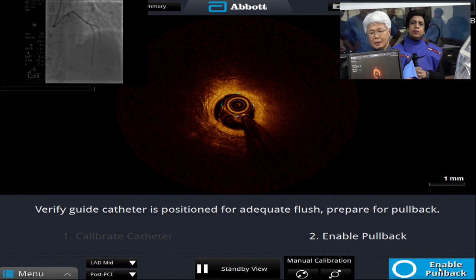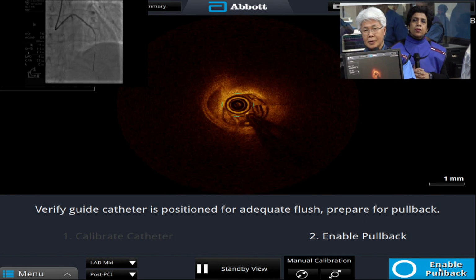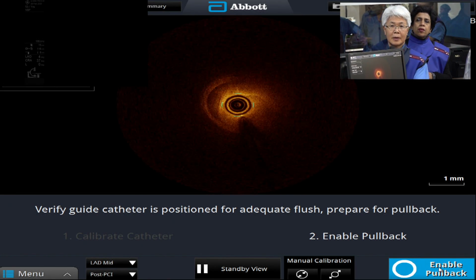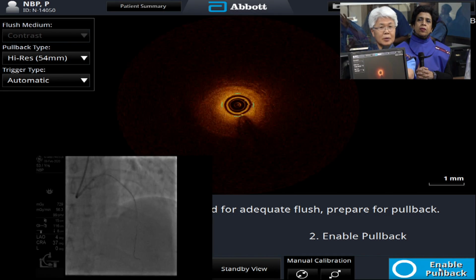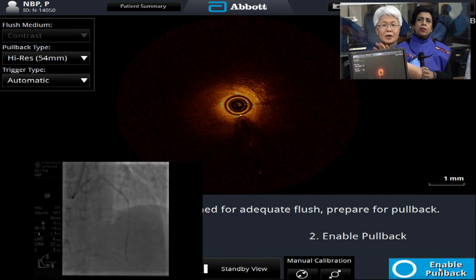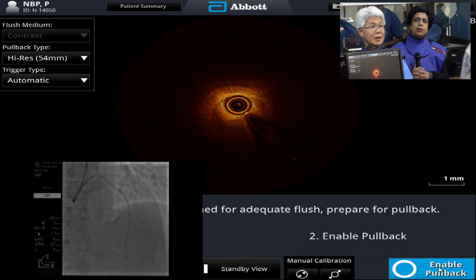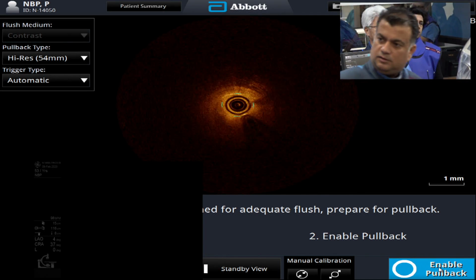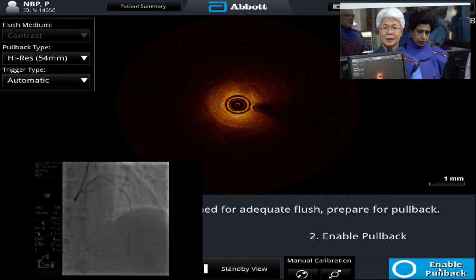Sir, I'm having one question. What we did is we put the two stents, then we did the pullback.